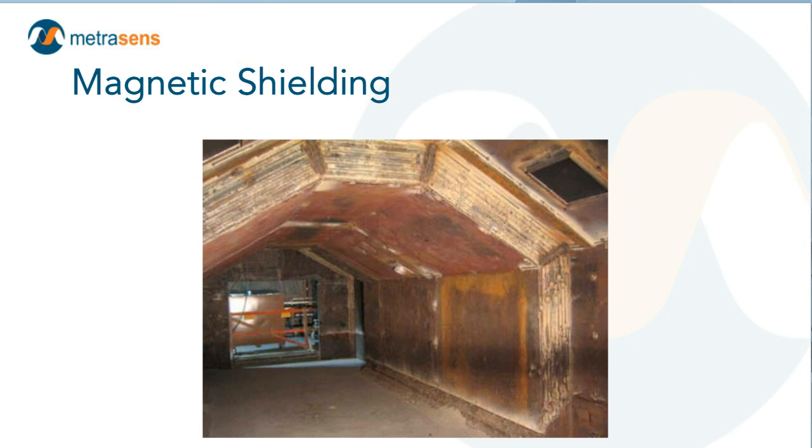Magnetic shielding cannot be avoided in all instances. There are sometimes you simply have to use it. My recommendation is to try and figure out if at your installation you can avoid it before you commit to using it.